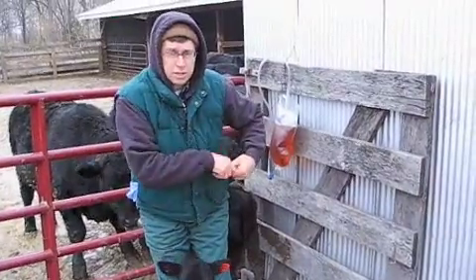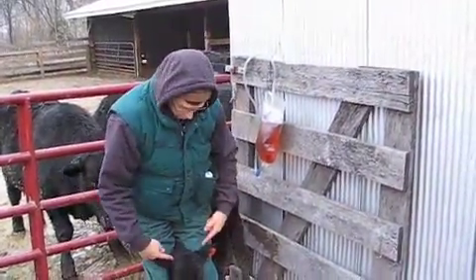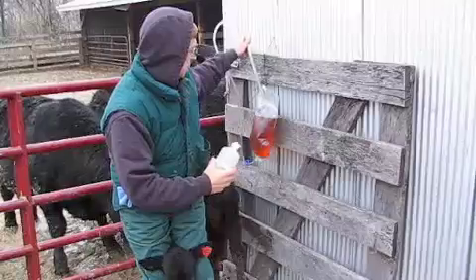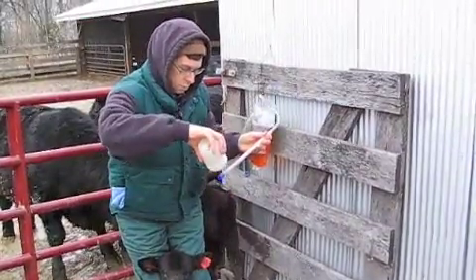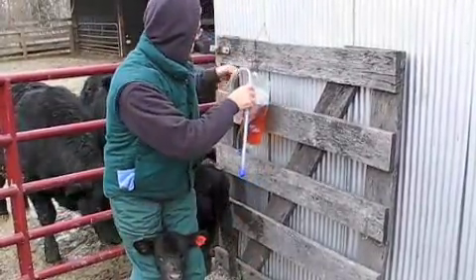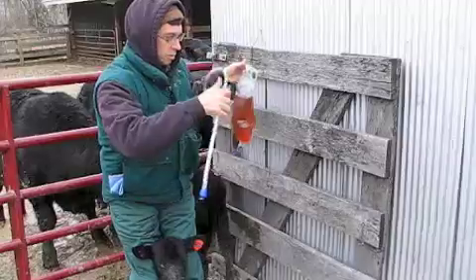The first thing I want to do is get the calf's butt in the corner, get his head in between my knees and hold it pretty tight so he's not moving around. Got my electrolytes ready, put some lube — Vaseline, something on the end — so that when I pass it down his throat it goes nice and easy.